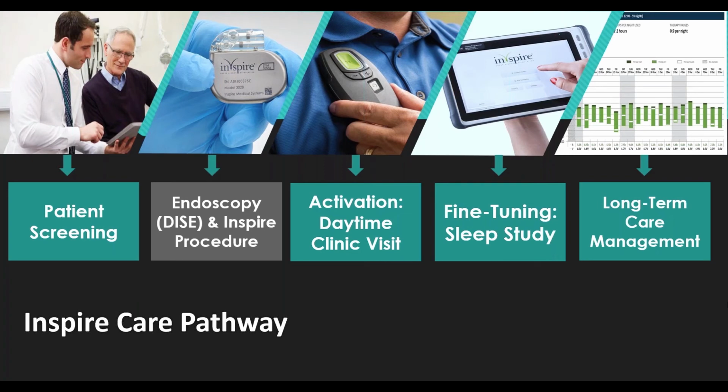They had to change the battery in their remote control, and they forgot to put new batteries in and such, because that's actually a separate battery in the remote control than in the device itself. The remote control has just regular over-the-counter batteries. And she'll help them troubleshoot those kinds of issues. And again, they'll have follow-up with the sleep physician until they're optimized. And then after that, we will see them just periodically. Usually once someone is established, it would be 6 months and yearly.